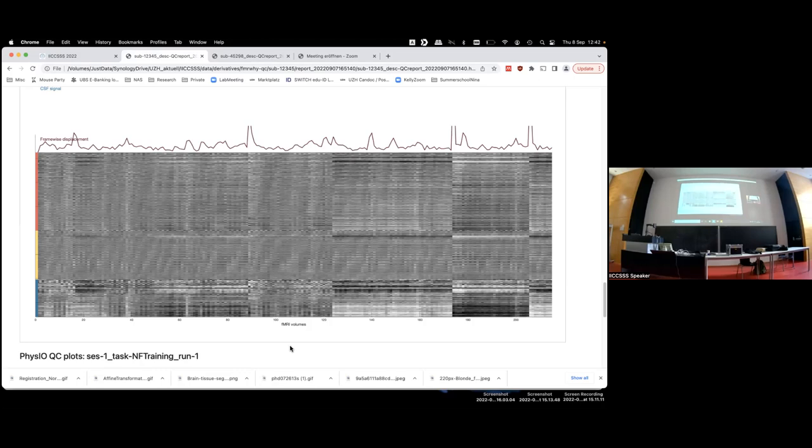So here, if you see these edges in the data, that corresponds to this, which is an open thingy, so it could not even be plotted. The frame-wise displacement is big, so the participant moved suddenly and unexpectedly. Then you have such a big jump in your data that you have to cut out this part of the data, and this part, and this part. So that's the normal solution. Otherwise, you have these jumps in your data. You might do some smoothing, but that also changes your data. With regard to your paradigm that you're relating to these data, it's better to cut it.